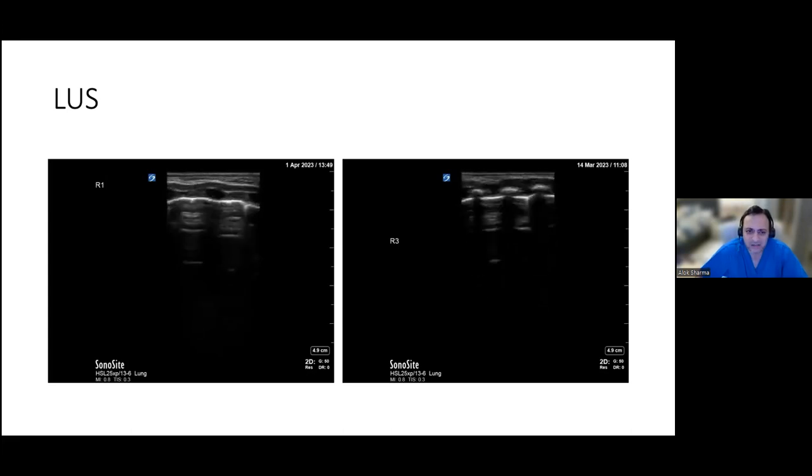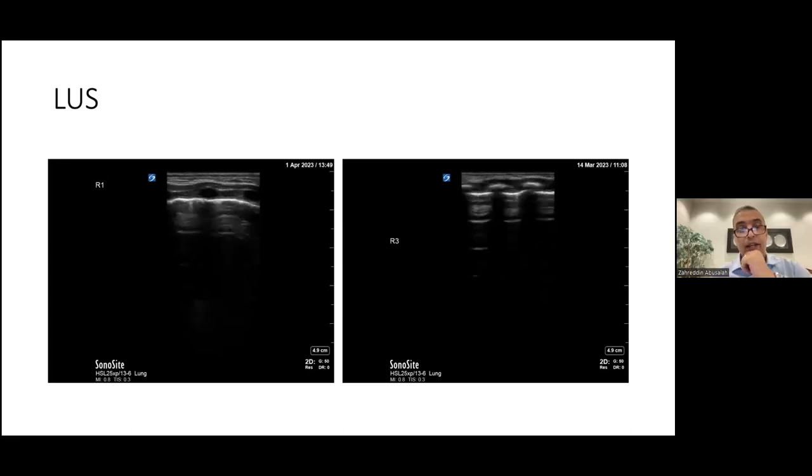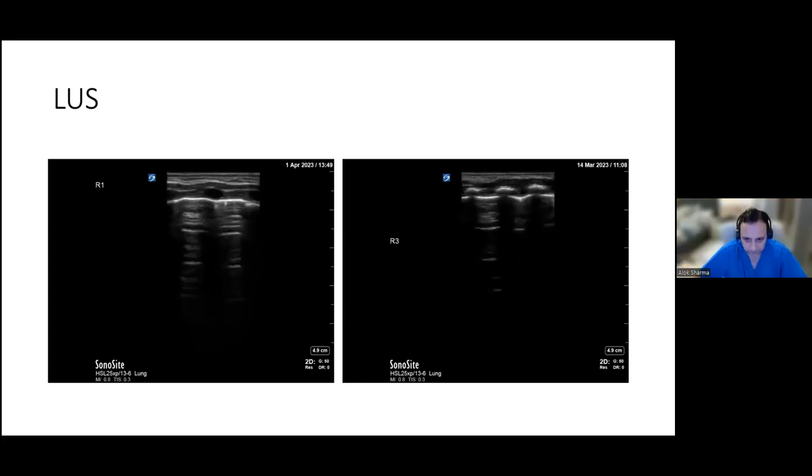And just this is kind of an X-ray that's not been done a while back. This is contemporaneous X-ray and lung ultrasound, pretty much. They've been done at a similar time. Yes, they are. The chest X-ray was done the day before, and then the report came across. Sure, sure. I mean, that looks normal.